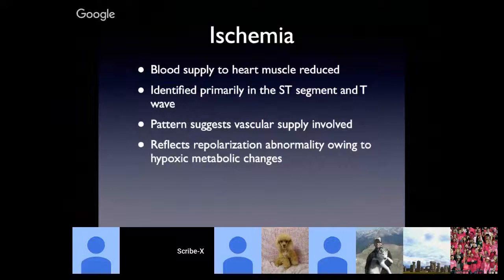Ischemia. All right. So when we talk about ischemia, what we're talking about is the heart is under strain because of inadequate blood supply. And the word ischemia can apply to any organ. Theoretically, your spleen could be ischemic, although that never happens. But the brain can be ischemic, right? So ischemia to the heart results in characteristic findings on the EKG that we'll go over.